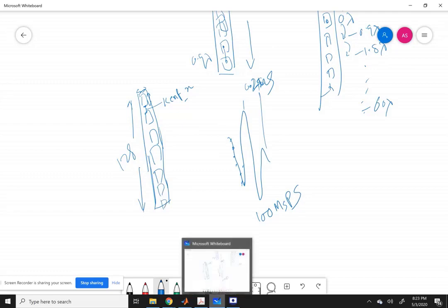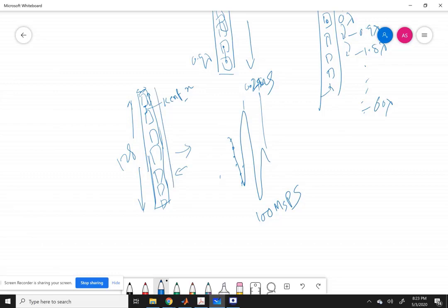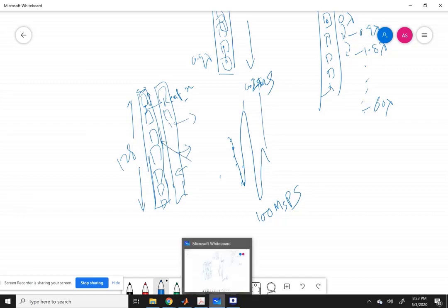We are also telling it that the same transducer will be used for transmission as well as reception. In Field 2 we can also define two transducer arrays, one used for transmission and the other for reception. But in this case, we are using the same transducer array for both transmission and reception.